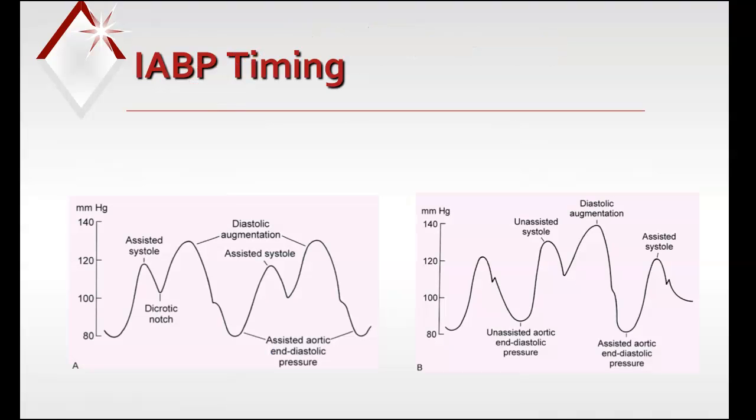And then this is what the timing actually looks like. Just like I said, it's going to read the ECG. It's going to do something called counterpulsation. This balloon therapy is known as counterpulsation because the timing of the balloon is opposite to ventricular contraction. So again, you would always think that you would want it to inflate with the contraction, but in fact, it's opposite of your ventricular contractions.